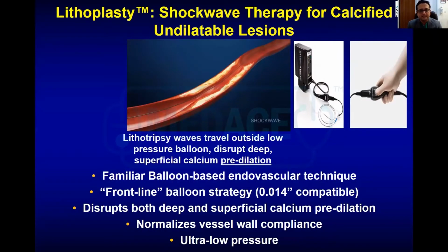And then lithoplasty. While I was in the US, I had the experience of using it in the peripheral world because it wasn't FDA approved for coronaries, and we used to use it for TAVR and such. It's not that hard to deliver the balloon, maybe not for balloon-uncrossable and undilatable lesions, but wherever it can go in easily, it's an amazingly safe tool to have. And probably once it comes to Pakistan, I'm sure people will find it not that hard to use.